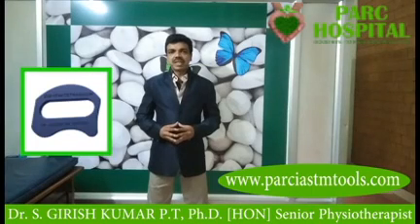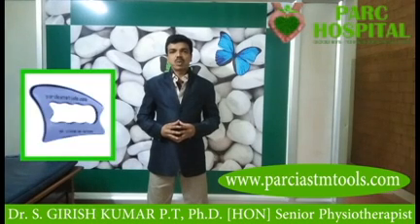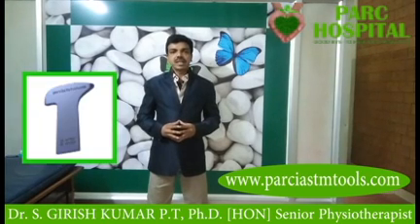Good morning everybody. Today we are going to see a different topic, that is IASTM. Instrument assisted soft tissue mobilization is one of the most popular recent methods introduced in physiotherapy to reduce pain and improve range of motion.